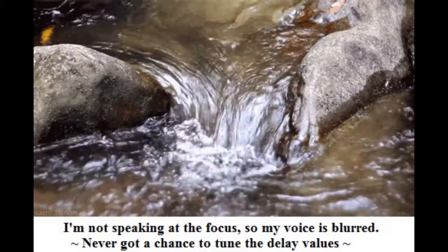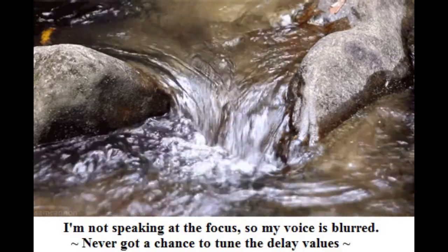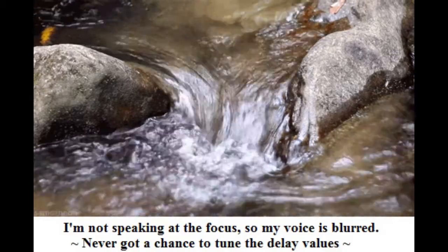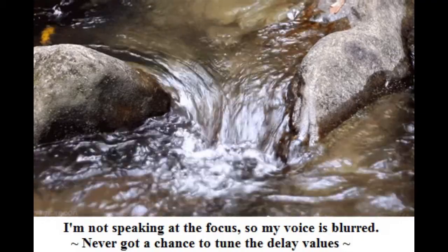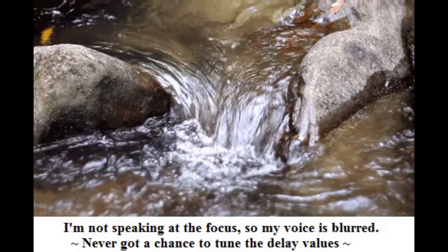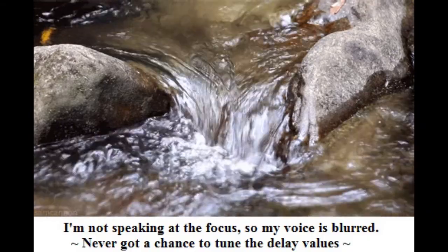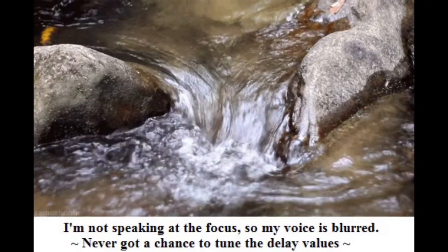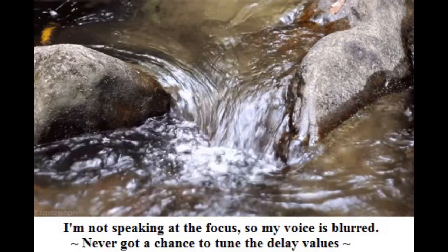And now a river sound. This is directly at the beam point. Now I'm going to move it out of the beam point. This is out. And now back. Out again. Back for a final time.